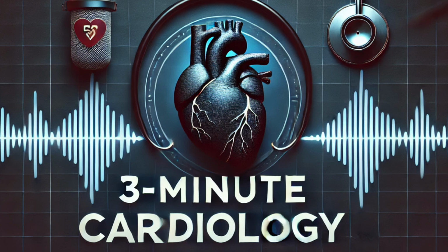In the differential with atrial rates: 100 to 180, you usually see sinus tachycardia; 140 to 220, we see atrial tachycardia, AVNRT, or AVRT; and 260 to 320, this is our atrial flutter. The P wave axis is usually upright in lead 2 and biphasic in V1, and that's normal.